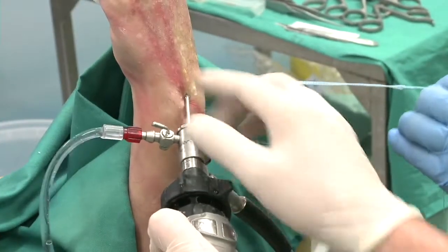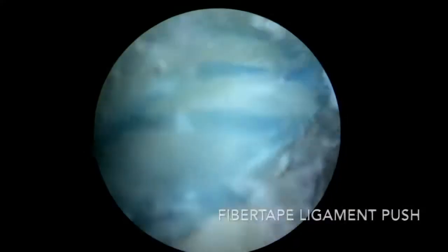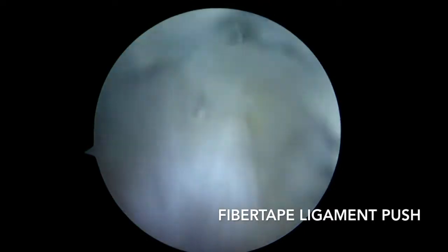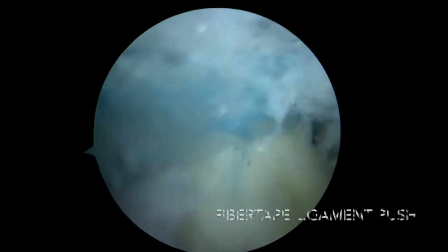With the arthroscope in the 4-5 portal, we confirm that there is good contact between the fiber tape and the dorsal interosseous ligament. Any excess fiber tape is then cut off.